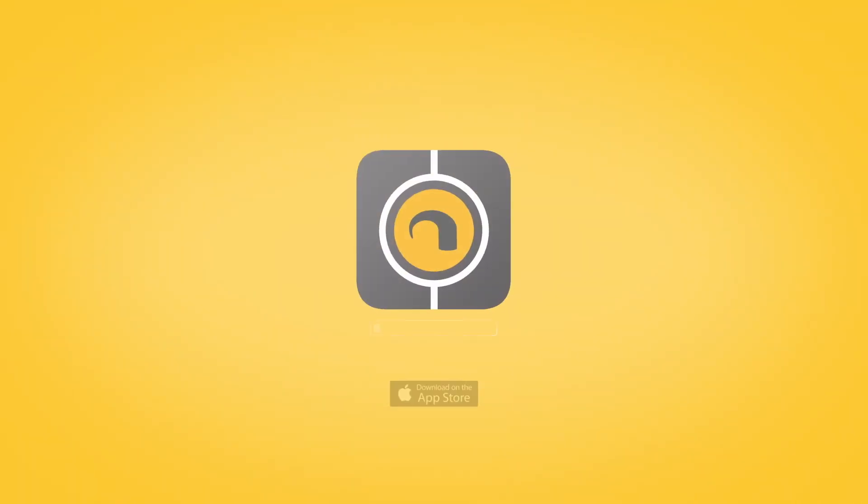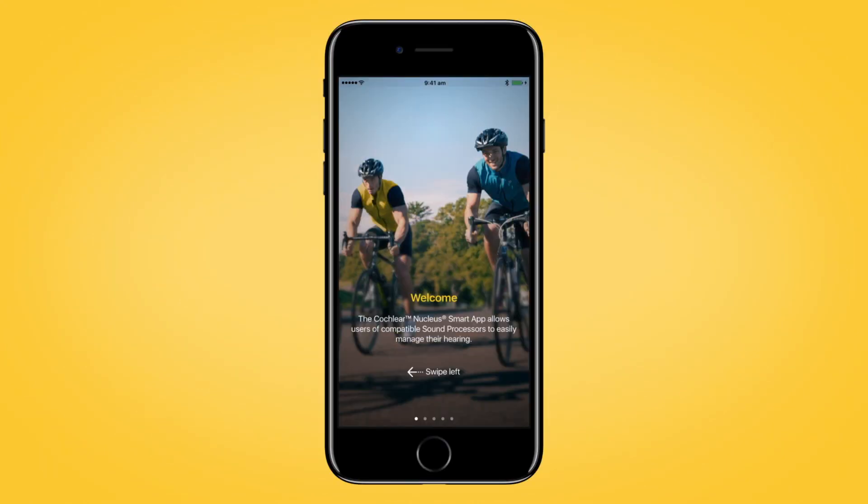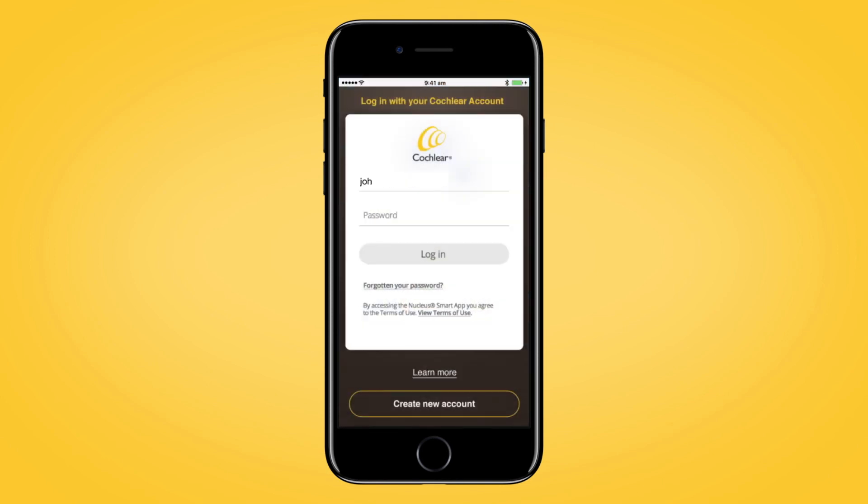If you have not done so already, download the Nucleus Smart App from the Apple App Store. Once downloaded, open the app and log in using your Cochlear account details.